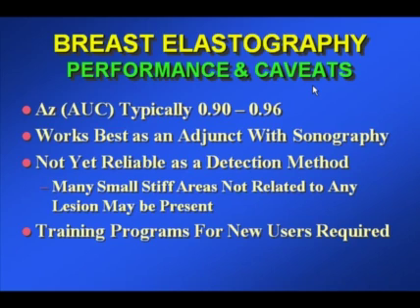At this point in time, I think some users have found breast elastography to be extremely useful and others have not found it to be useful, and I think it's partly due to the ease of use of software and partly due to the amount of training that has been supplied with the instrument.